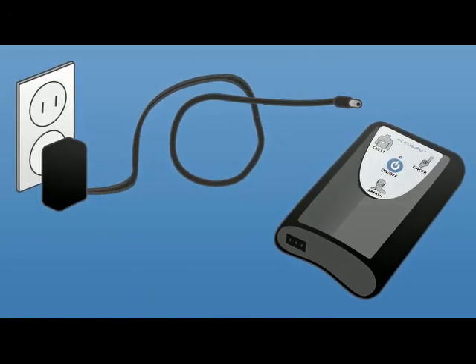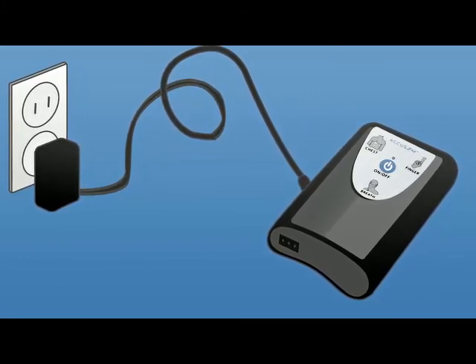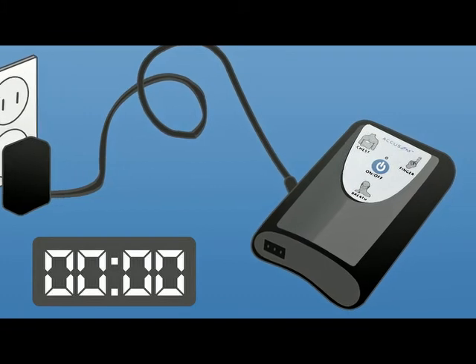Number two: plug the charger into a wall outlet and then connect the charger to the device. Number three: the device will announce 'now charging.' If not, press and hold the on/off button for two seconds and let go.